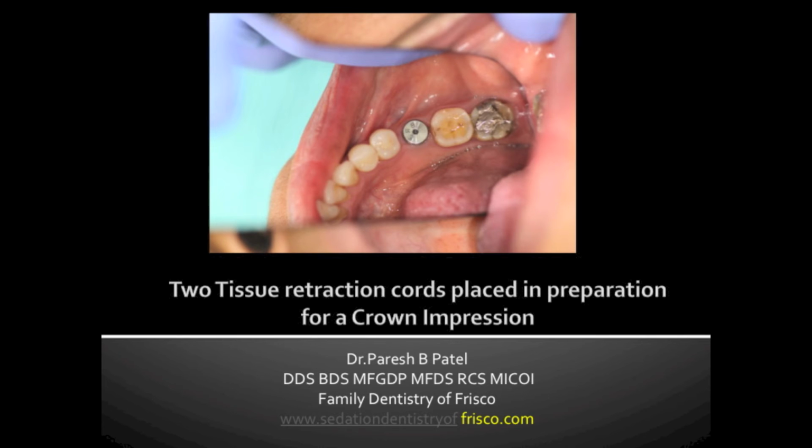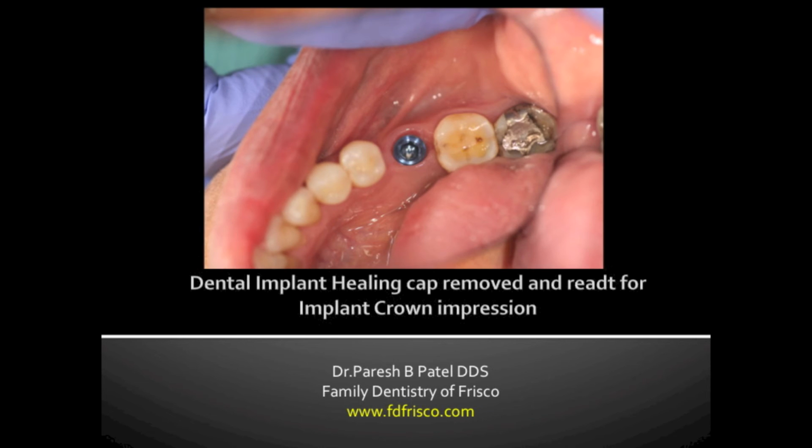In this picture you can see the dental implant in place with what I like to call a button stud. It appears to be like a little button stud, but it's a healing cap, and what that allows us to do is to form the tissues that connect the outside, or rather the inside of your mouth, to the dental implant. The healing process is usually between 10 to 13 weeks for full integration. In this case, integration was complete in about 12 weeks, and here you see a picture of the dental implant when we took the healing cap off at review at 3 months.